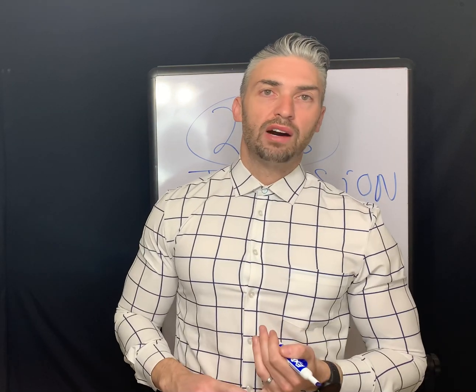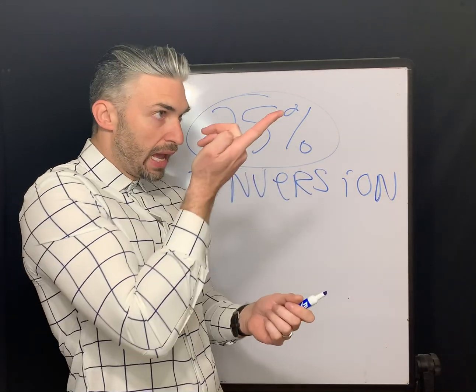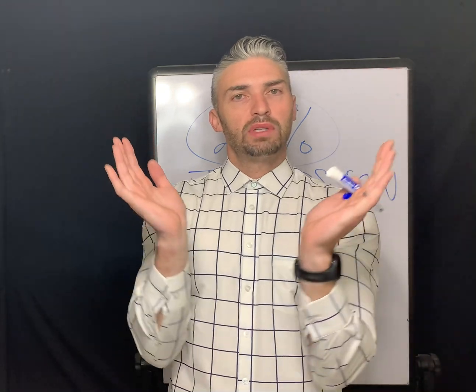The next way to check for inversion is examining the edge profile. You set the lens on your index finger, look at it from eye level, and what you're looking for is to confirm that the edge is not turned out — that it goes inward, shaped like a bowl.